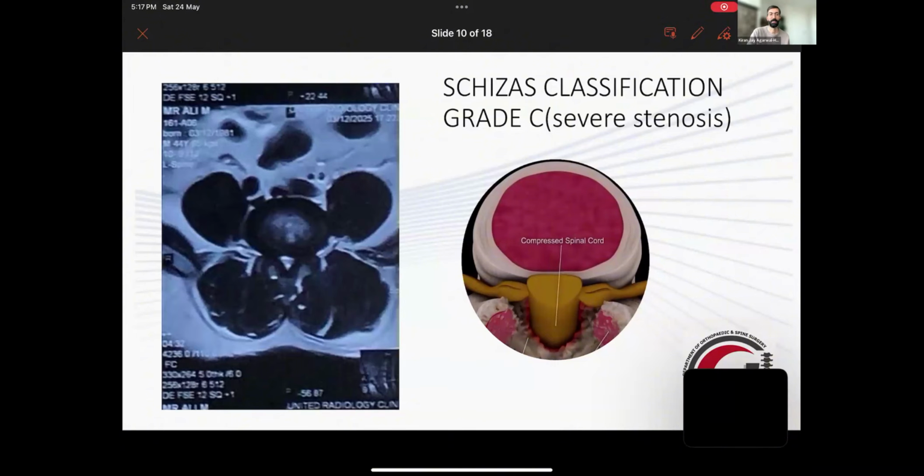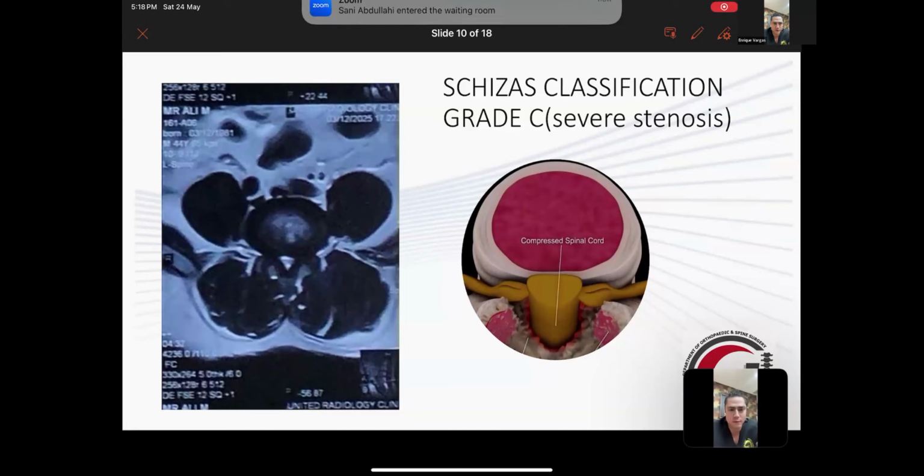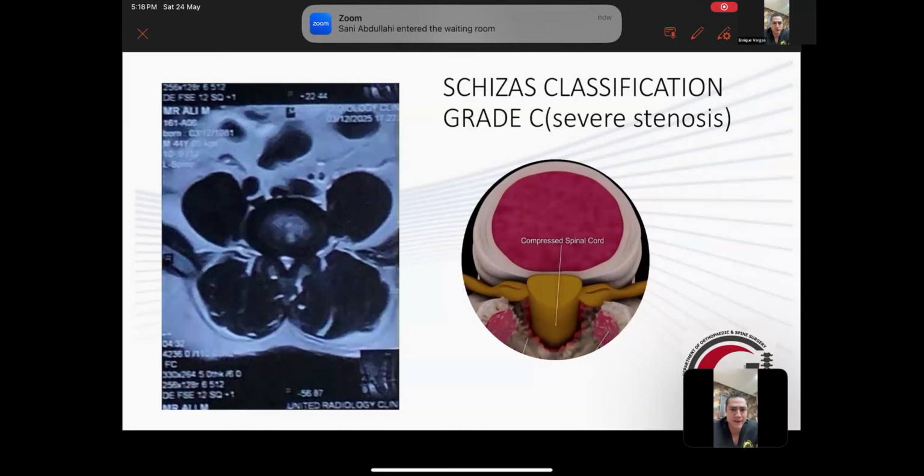Any of the faculty have a comment on that? When I have stenosis cases where the disc seems not protruded and the stenosis comes more from the ligamentum flavum, I only resect the flavum. I don't see any case for damaging that disc, which is what I was thinking now that Dr. Rizwan was talking.